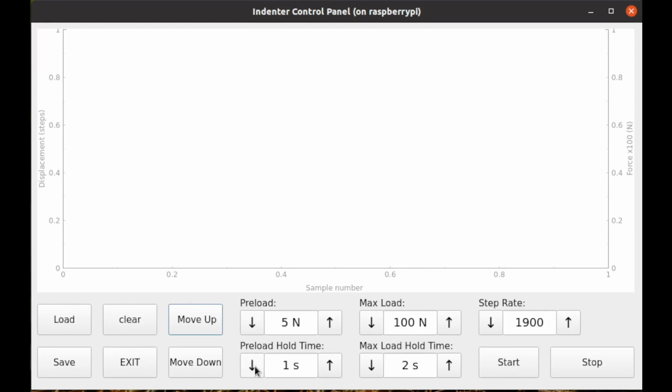These options down here let us control the parameters for a stiffness measurement. First is a preload. This is a small load that initially gets applied to the back for a given period of time. Once this period of time elapses, we go and apply our main load. And this load also gets held for a period of time. When we apply our load, we can set how fast it gets applied using our step rate option. This controls the step rate of the stepper motor.